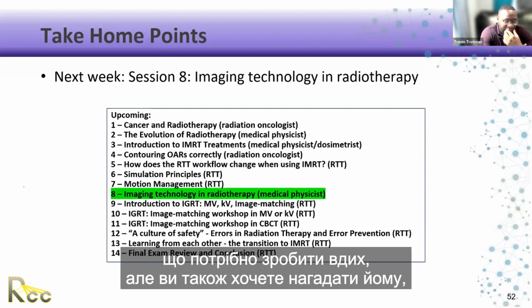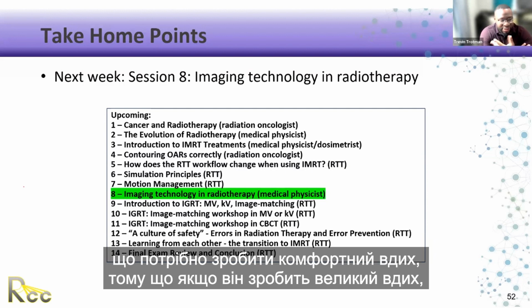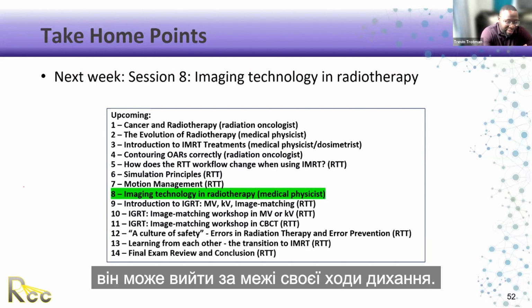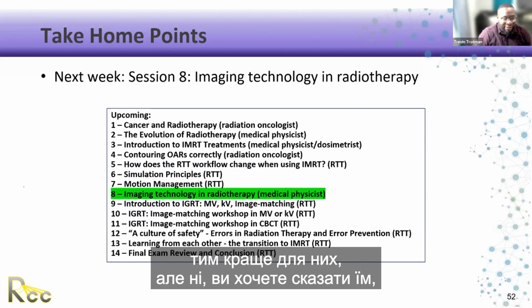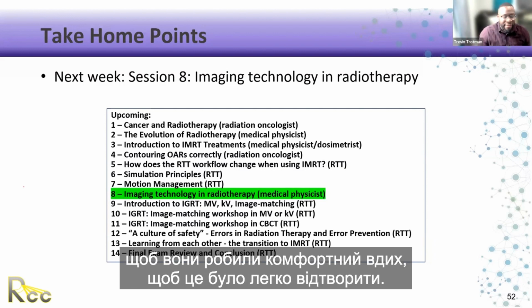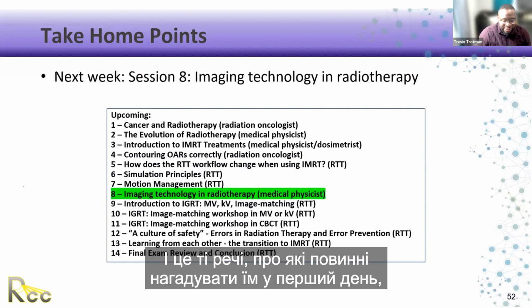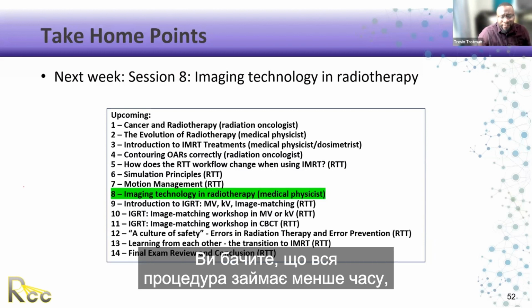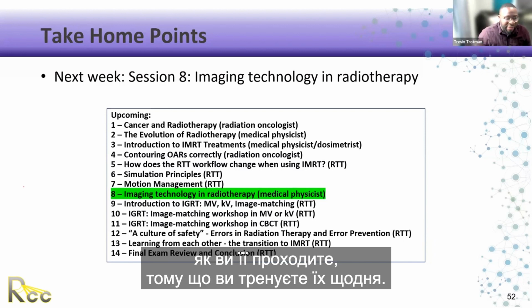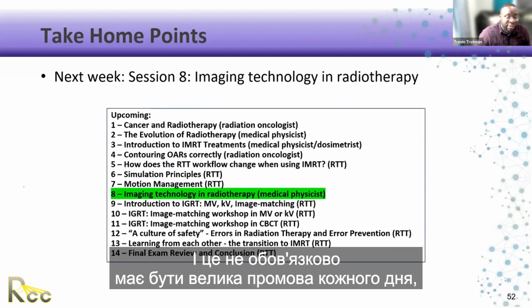So little things like, you tell the patient you want to take a breath in, but you also want to remind them you want to take a comfortable breath in, because if they're taking a big breath, they can overshoot that gate, and they think the more they take in, the better for them. But no, you want to tell them to take a comfortable breath in, so that's easy to reproduce. Those are things that you have to remind them on the first day especially, and every day. So that whole procedure goes as far as you take it, because you're coaching them every day.